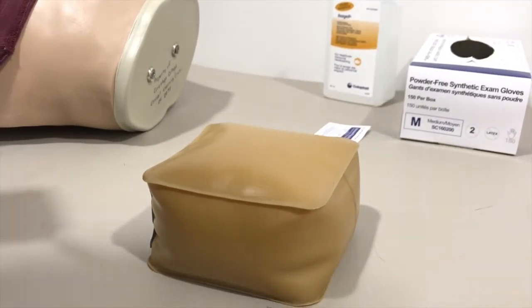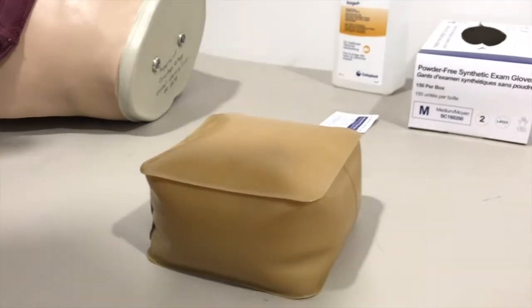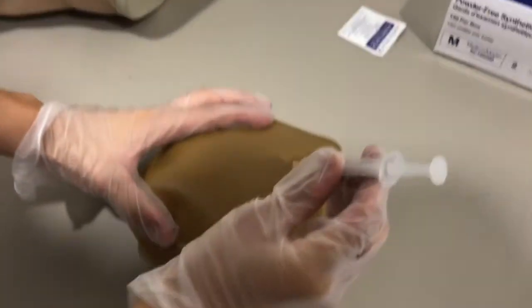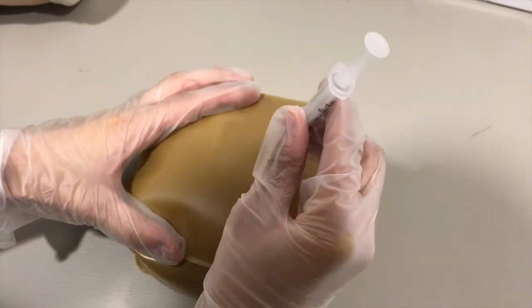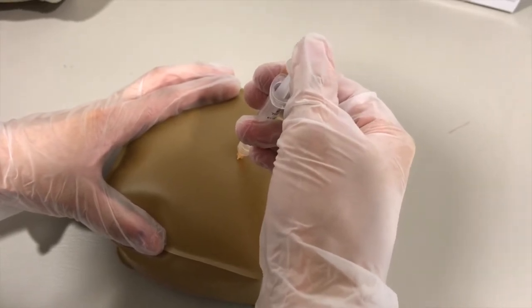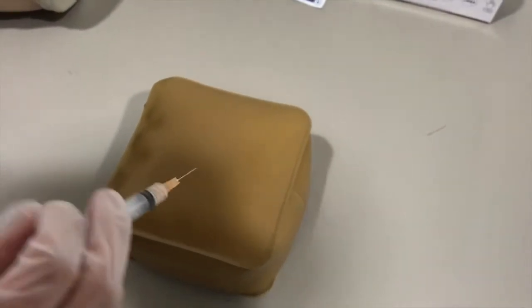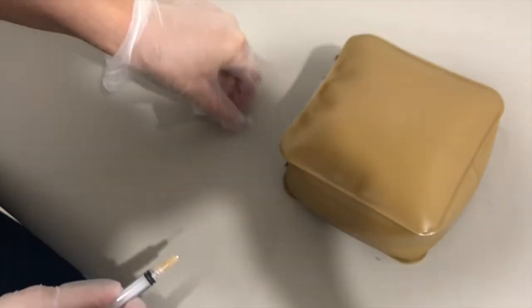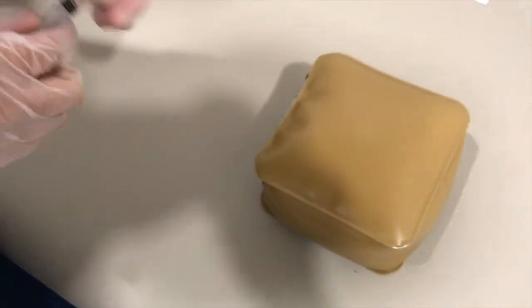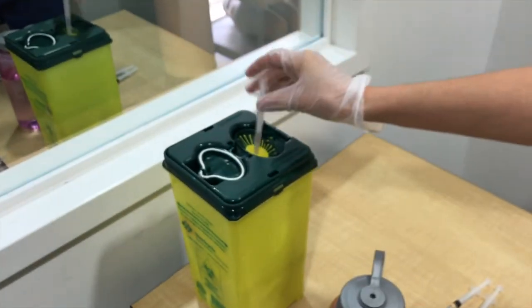Okay, Dwight, so next I'm going to open the needle at a 90-degree angle with my arms pointing outwards. And I am now going to make sure that I am injecting at a 45 to 90-degree angle, injecting the medication slowly, and then pulling out. And then the next thing you want to do is have a hard surface to do your needle recapping with, and dispose of this in the appropriate location, which is going to be the sharps bin located right over here.